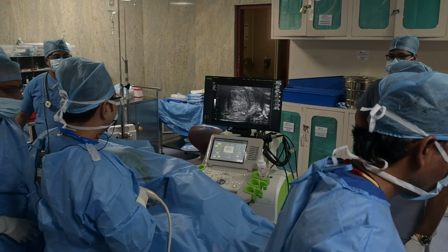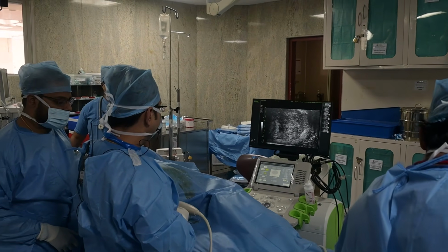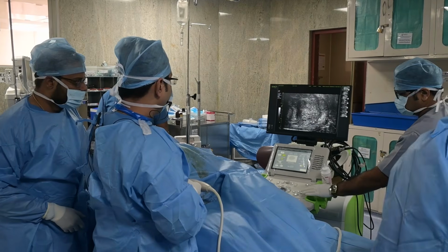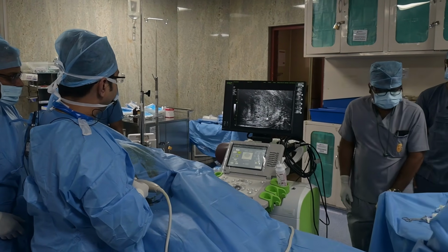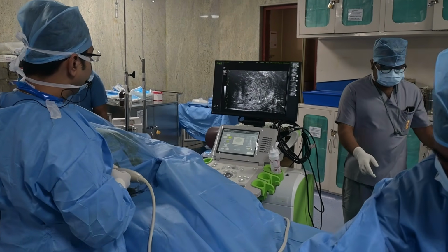So this is my first target. As I told you, the starry sky appearance. You can see there. Yeah. So you see big dots and small dots. Two big dots are separated by a centimeter. Okay, so this is my first target.